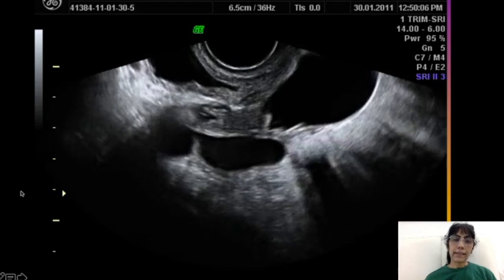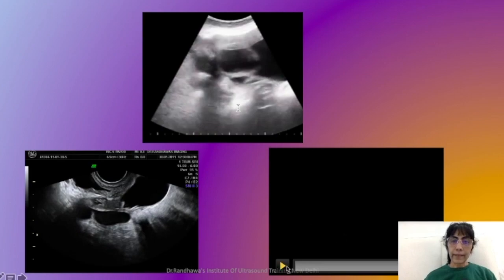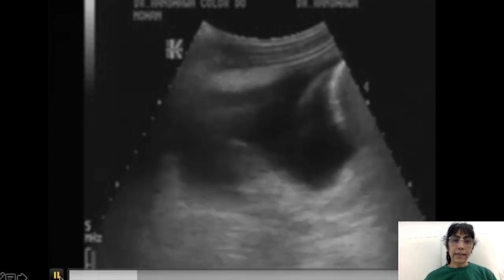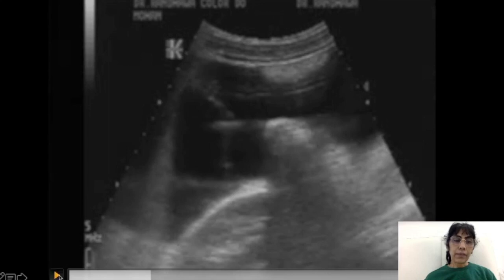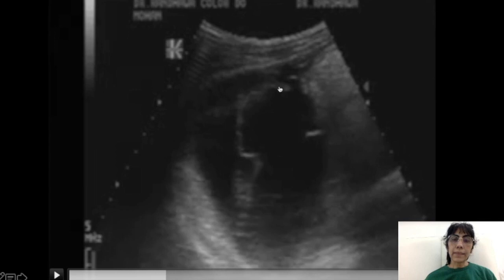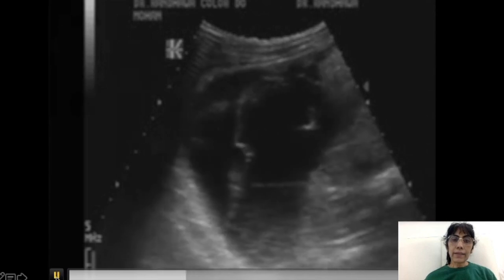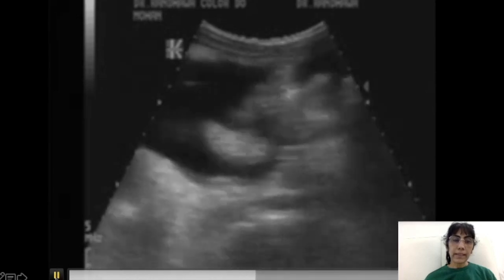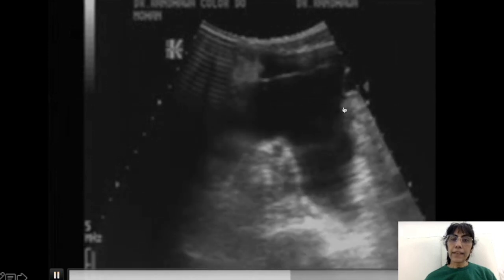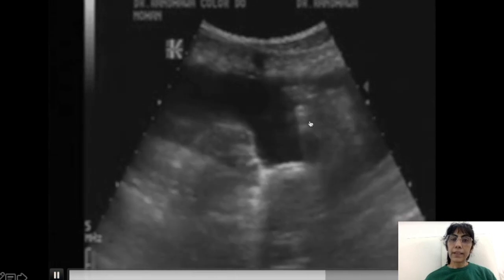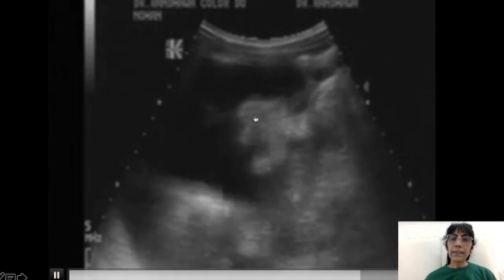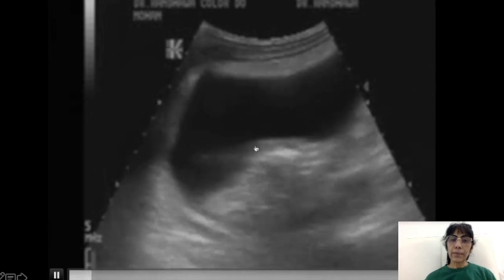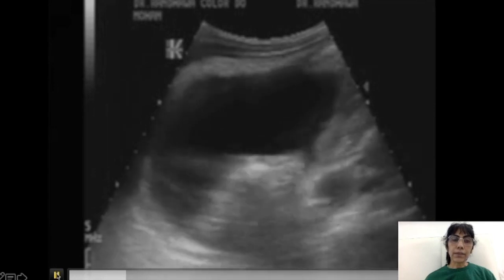Now looking at another example: I see some fluid collection, and as I move further I find septa here also, so initially there is doubt whether this is a multiseptated mass. But observe carefully as we move — the septa are not tense, they are loose. And as I move further I find bowel areas within it — I can see the bowel areas very clearly here. They are all within this fluid; I can see the shadows and bowel areas within this portion. So this is loculated ascites, not a mass lesion or cyst adenoma.